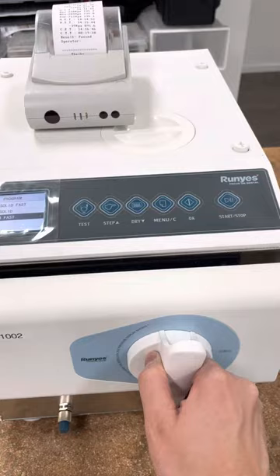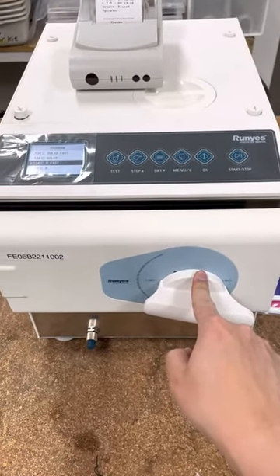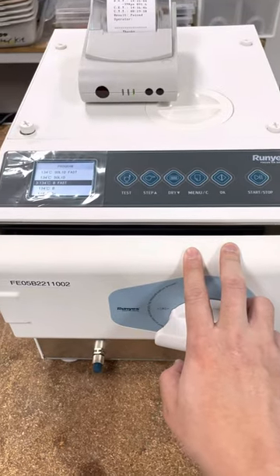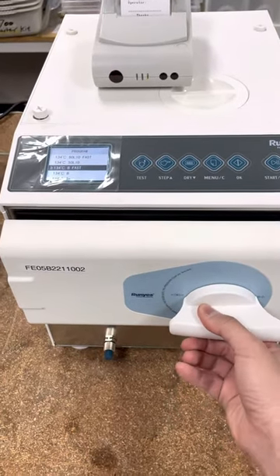The door has a double locking mechanism, which means that when the machine is under high pressure during sterilization, you won't be able to open the door — you'll be locked.